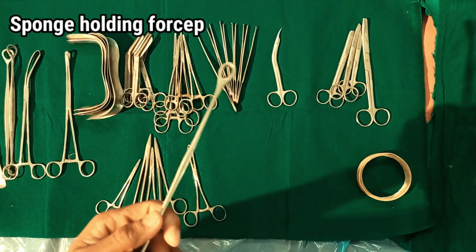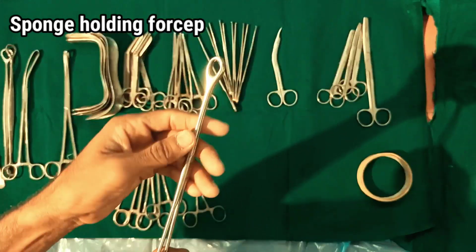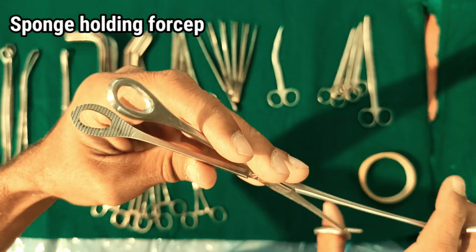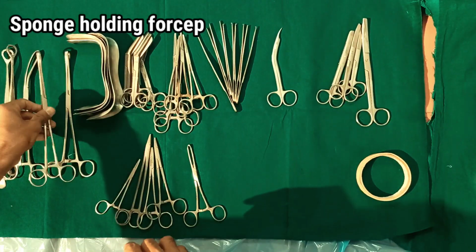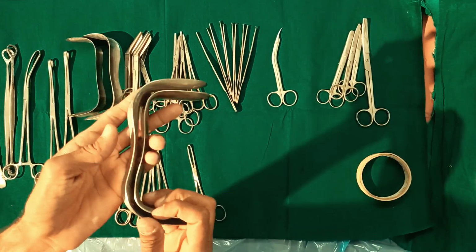The handles are ringed as well as looped. Sponge holding forceps can either be curved or they may be straight. The shape is different for each individual purpose for which they may be used.